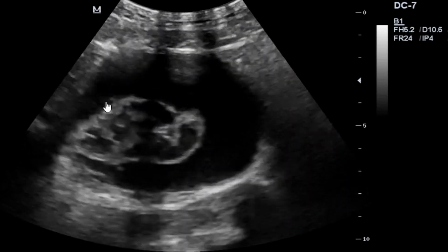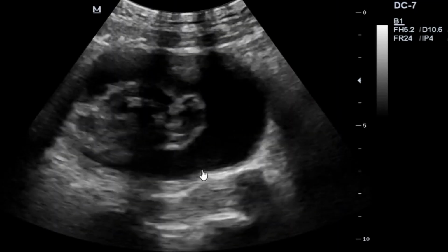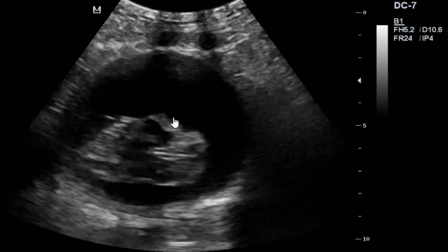I think you can appreciate what I'm referring to as the hematoma here. You can also have other lesions in the urinary bladder. You can have cancerous lesions, and you can also have other non-cancerous lesions, which can have attachment to the urinary bladder and feed from it. So this is a case of what we refer to as a vesical hematoma.